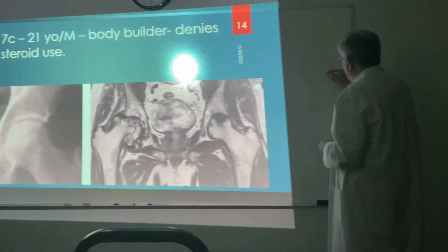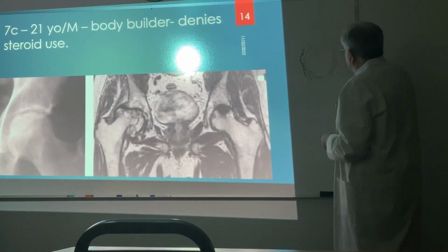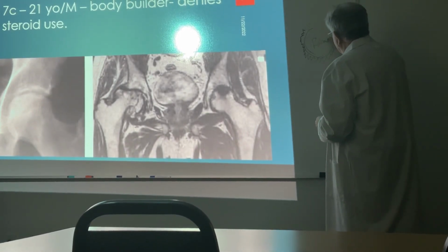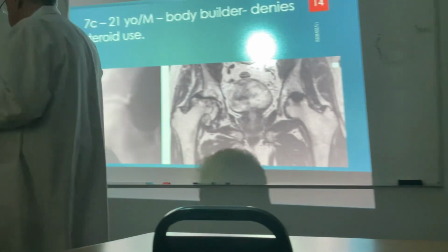So this is the rotten part of the apple. Anything around it that's trying to contain it, just like an infection. Increased bone marrow edema. This is the rotten part. And for someone to look at it, it reminded them of the Krispy Kreme donut, and that's why it's called a donut lesion of osteonecrosis.